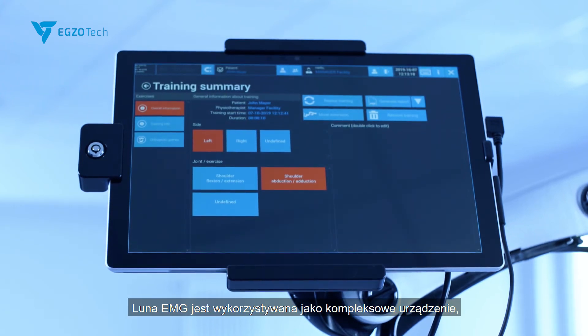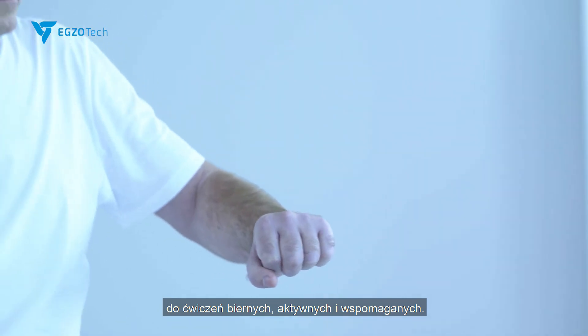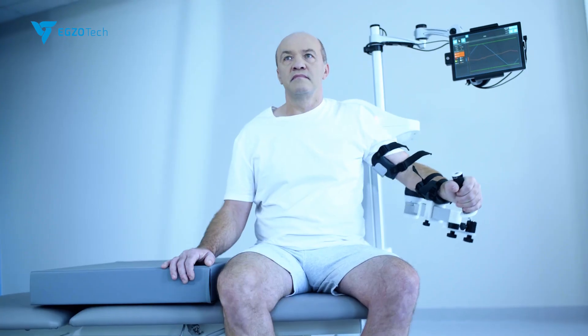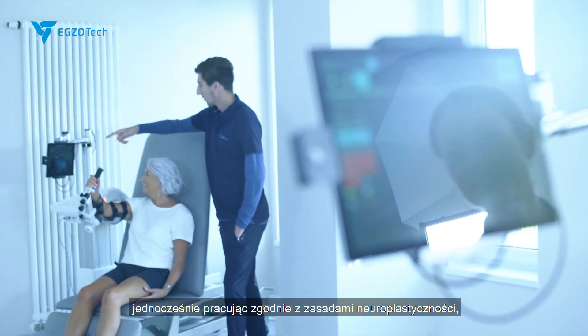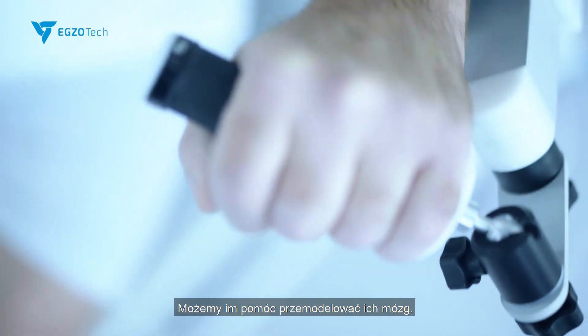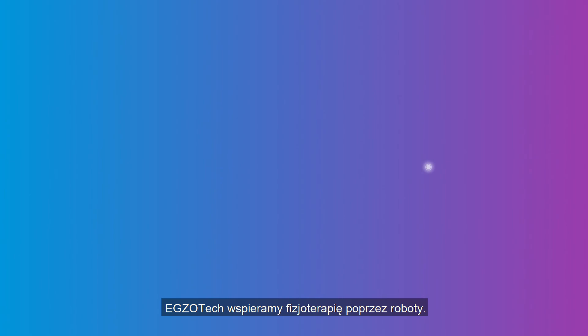Luna EMG is used as a holistic device with passive, active, and active assistive training. Robotics can help patients perform exercises beyond their limits. Summarizing, we have an assessment and training tool for patients in all stages of rehabilitation. We can adapt the training to work with different kinds of pathologies and really work according to neuroplasticity rules to better support our patients. We can help them rewire their brain and gain back the functions which they've lost. EGZOTech, empowering physiotherapy with robots.